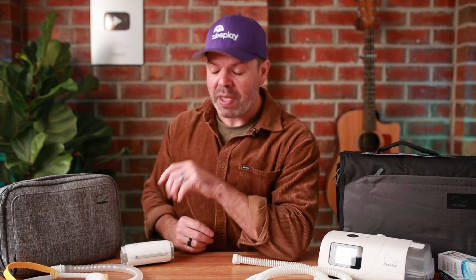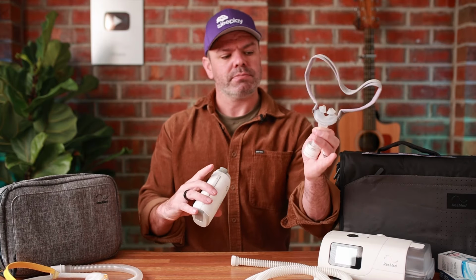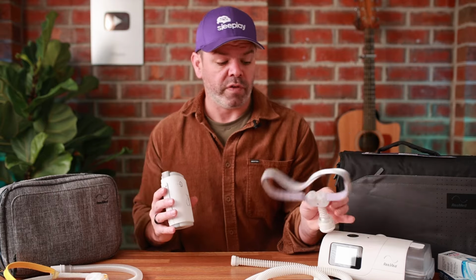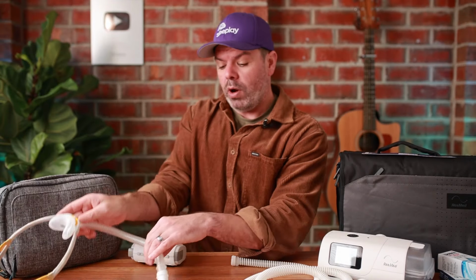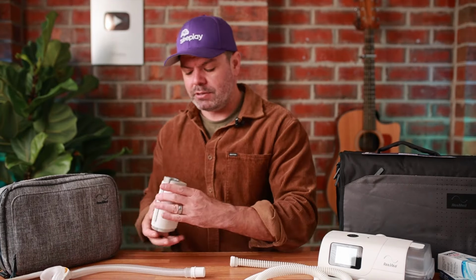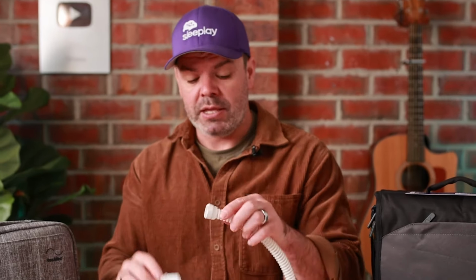Now, before I go, I want to share a few pro tips to help you get the best out of your AirMini. Tip number one, ResMed designed the AirMini to work exclusively with their range of Humidex compatible CPAP masks. But what if you like something else? What if instead of this P10, you prefer the Fisher & Paykel Solo auto-adjusting, auto-fitting headgear? Check that out. Very nice. Well, you're kind of stuck because the tubing with the AirMini won't connect.